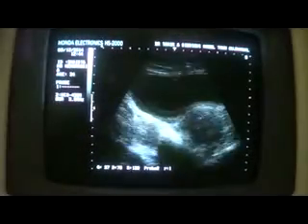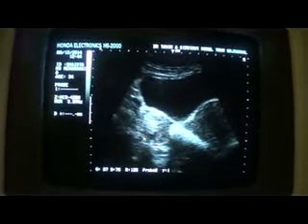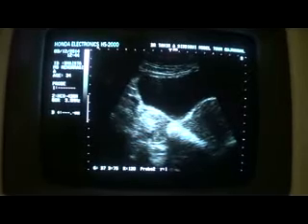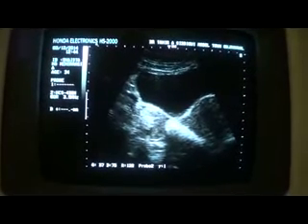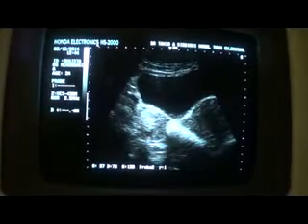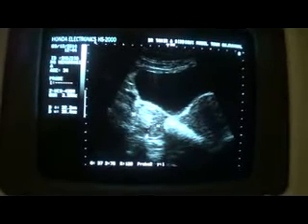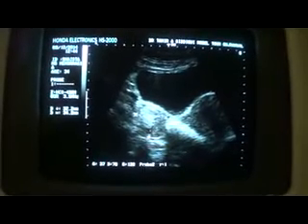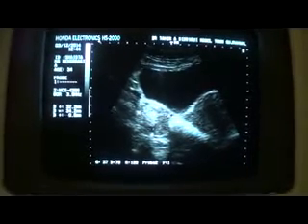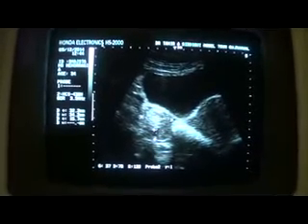When I move the probe towards the right adnexa, we see there is a well demarcated echo-filled cystic area, thick echoes, very thick echoes, with a central echogenic area, dense coarse with no posterior shadowing at all. Now this cystic mass on the right side, in the region of the right adnexa, measures approximately 34 millimeters by 32 mm, and there is a central echogenic area. This central echogenic area is the solid element within it.